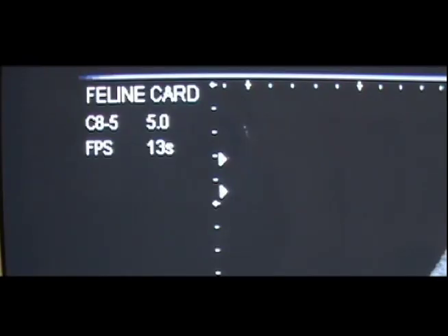Image quality will depend on the frequency of the transducer. The transducer frequency you choose will depend on the depth of the image you wish to see. The heart in cats and small dogs will be at relatively shallow depths, allowing the choice of high frequencies. Many ultrasound machines have a variable frequency transducer in the range of 5 to 8 MHz or 6 to 10 MHz. You would probably choose 7.5 to 8 MHz to view the cardiac image in cats or small dogs.